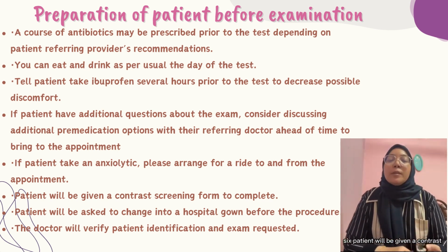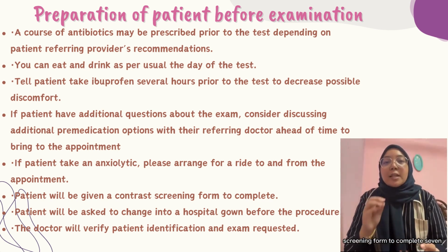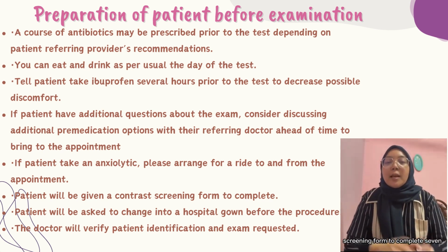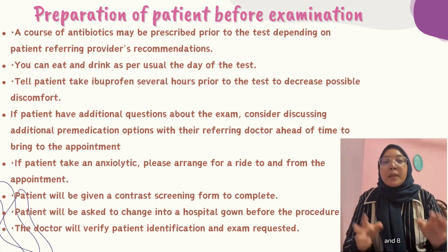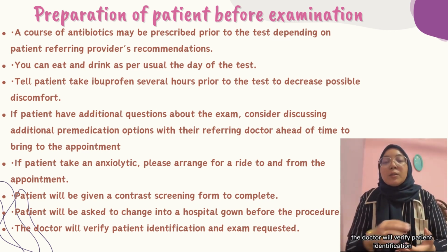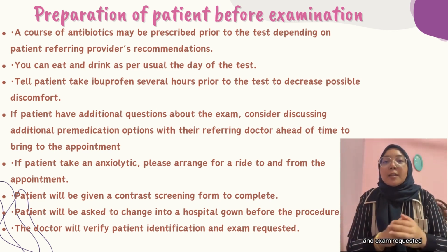Sixth, the patient will be given a contrast screening form to complete. Seventh, the patient will be asked to change into a hospital gown before the procedure. And eighth, the doctor will verify patient identification and exam requested.